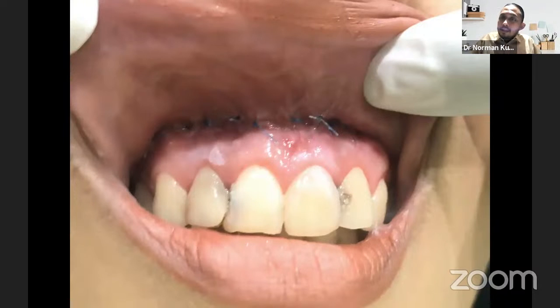As we can see, it's not 2 weeks. Everyone maybe mentioned 14 days, but it's not 2 weeks. It's a 10-day control. So it's 4 days faster than the regeneration of my usual lip reposition. In my usual lip reposition, I do a 2-week control, and the result is like this. But with laser, at 10 days, the result is already like this.